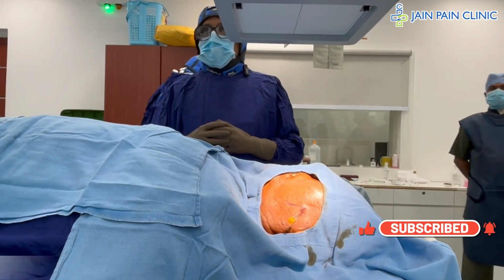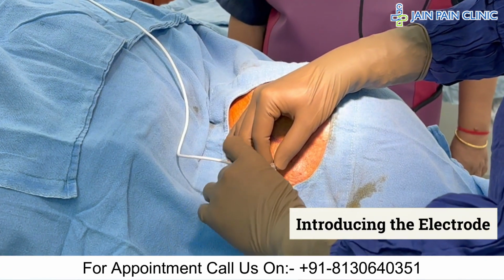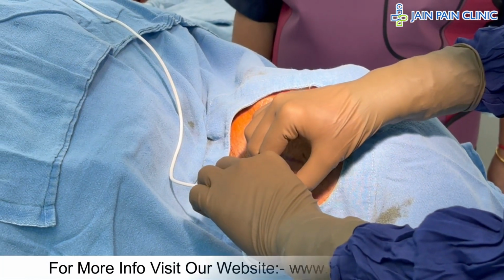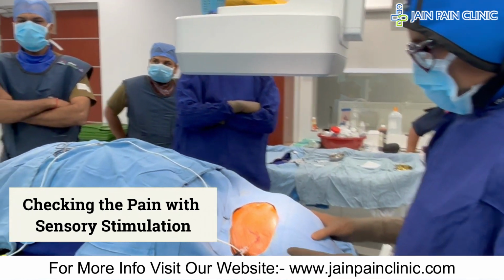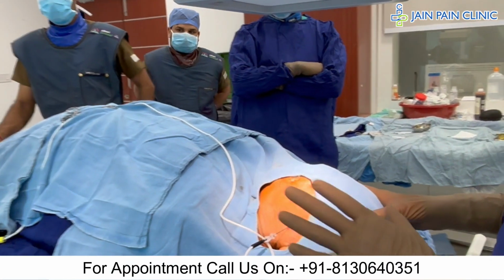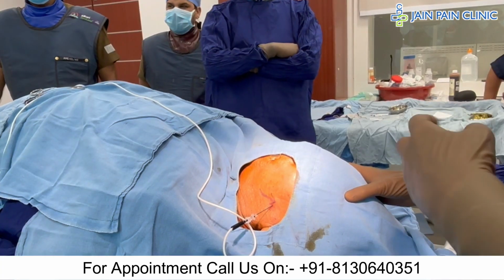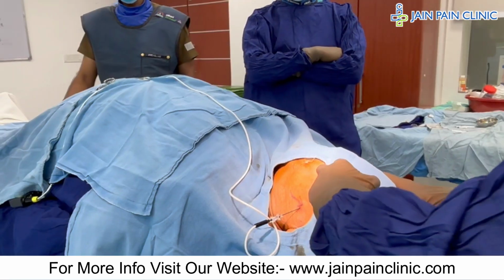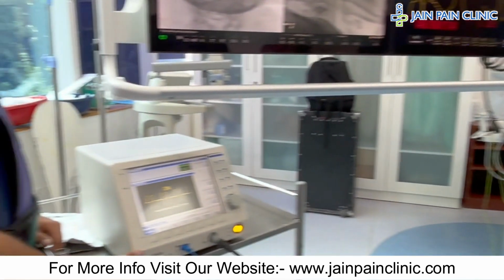Now we will stimulate and ask the patient where the pain is coming. Now we will introduce the electrode. Now we will do stimulation and ask the patient where he is feeling the pain. Now we are doing sensory stimulation. Start, and the patient will feel pain at point 2. We have asked, and the patient is feeling pain at the back of the pharynx, and is not feeling pain over the distribution of the infraorbital nerve or in front of the nose. So we are perfectly placed and good stimulation achieved at point 2.